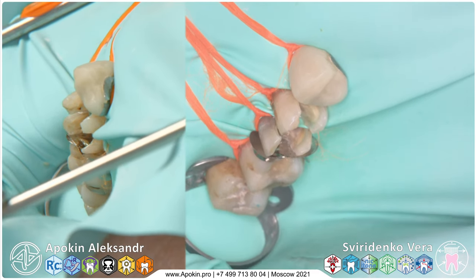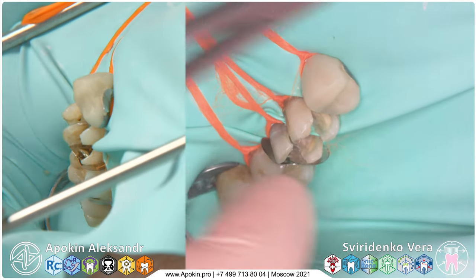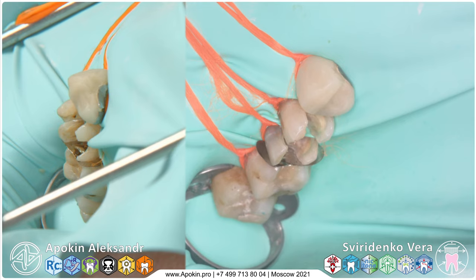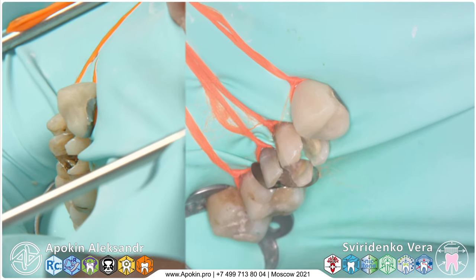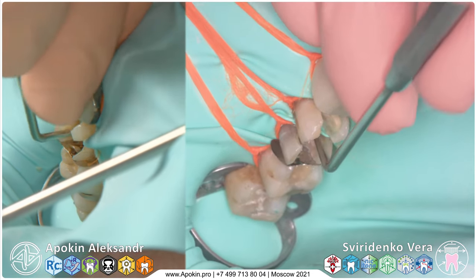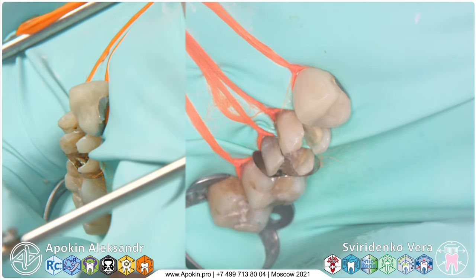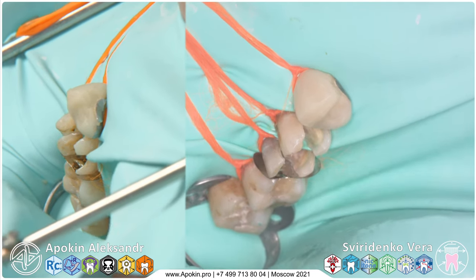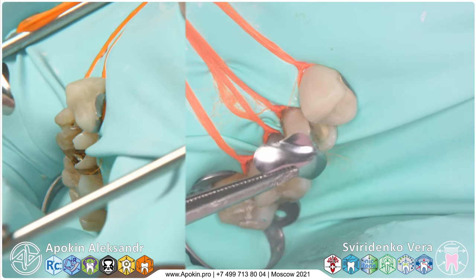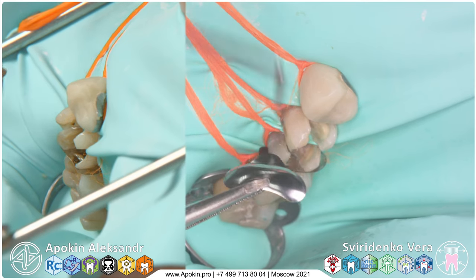Remove one matrix that covers the mesial wall of 16 and leave in the previous place the matrix of the distal wall of 15. Then again hold the floss with the probe and try to insert matrix in the mesial wall. A new kind of matrix in this case, with the under-gingival part.